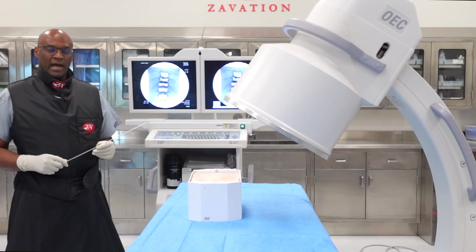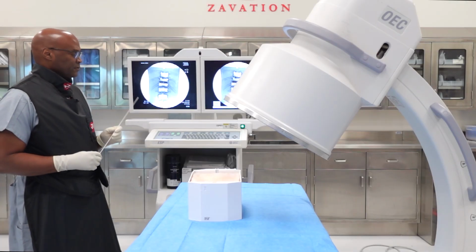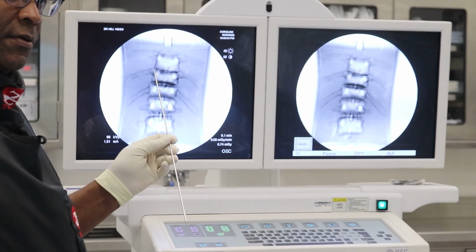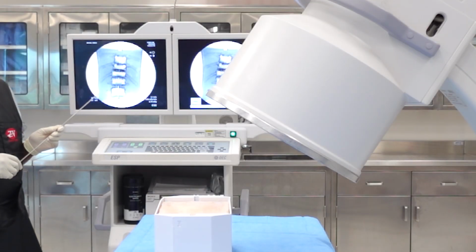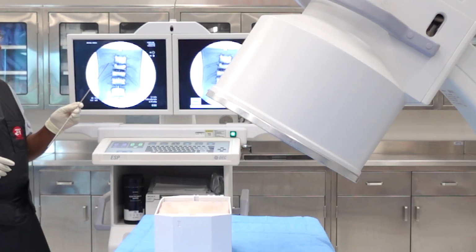So let's look at the anatomy of the vertebral bodies before we begin the procedure. The first thing that we want to identify on the AP is the pedicle. The pedicle should be at the top third of the vertebral body. In the thoracic spine, the pedicle is usually more oval, and in the lumbar spine, the pedicle is usually more round. So as you can see here, you can see both pedicles.